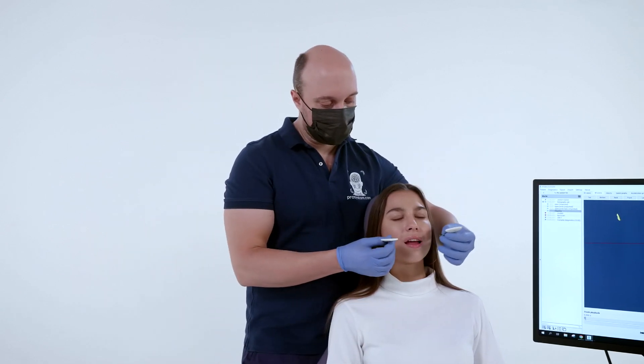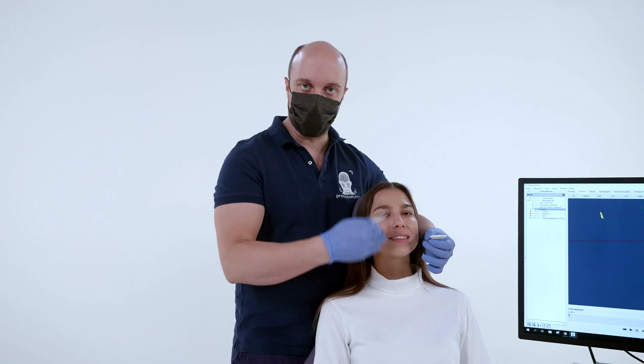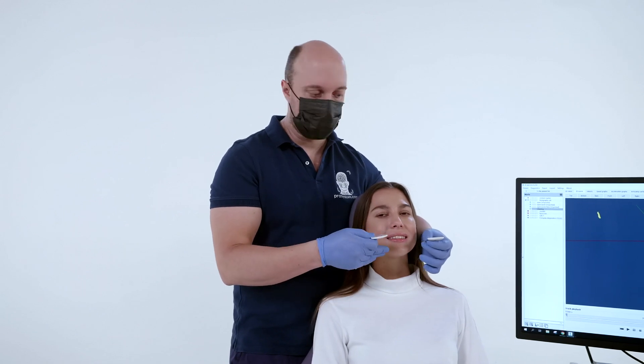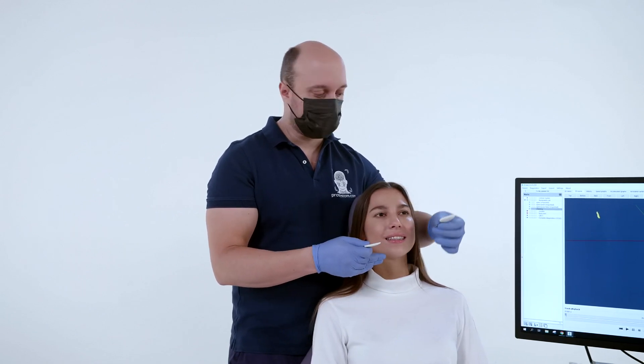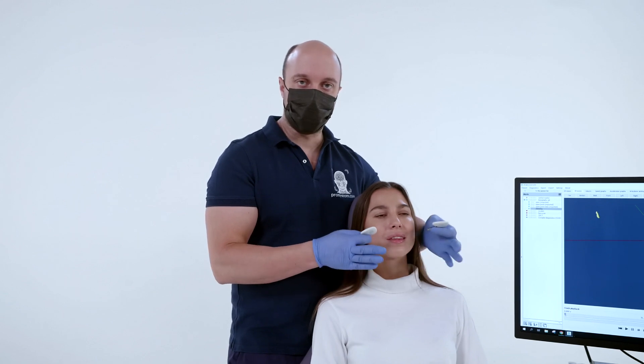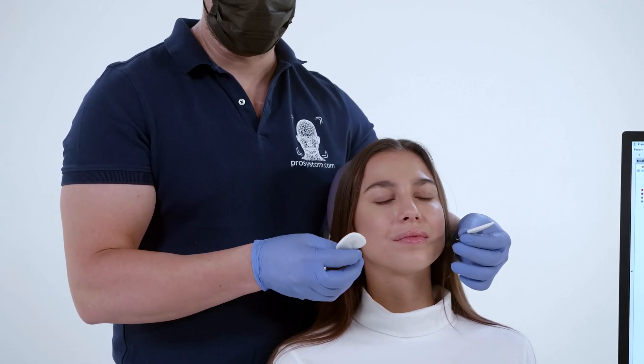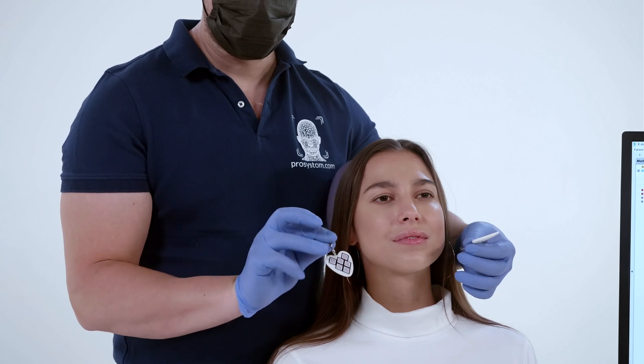In order to recognize which marker should be attached to the upper jaw and which marker to the lower jaw, there are black dots on the markers. When fixing, these points should be located closer to the auditory canals, positioned towards the outside.